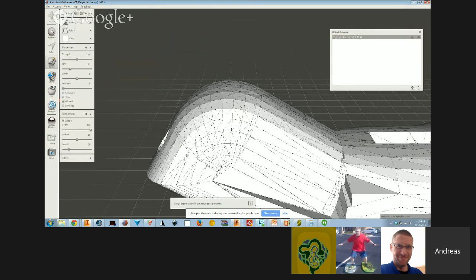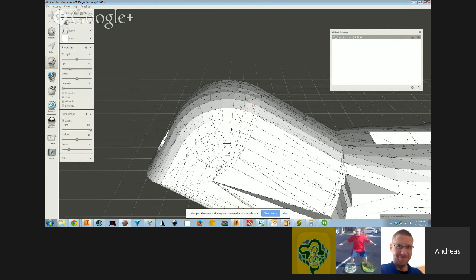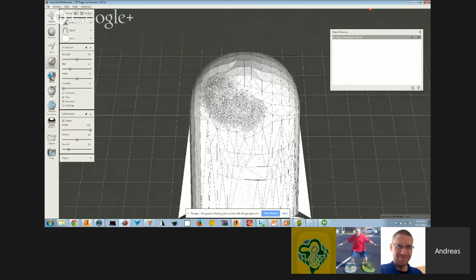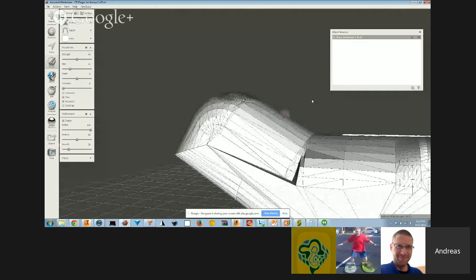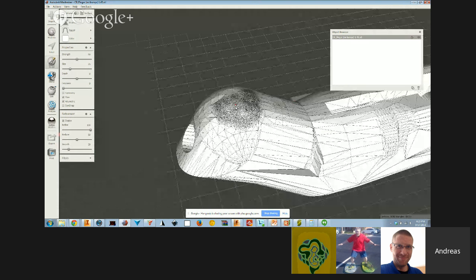So what I can do is use my brush here. If I go to the volume brushes, just toggle this thing. I have a refine brush down here. And what I can do is just start to paint more triangles on there. So if I zoom in, you can see I'm just adding triangles to this. It's not changing the geometry. It's just inserting vertices or triangles into the model.